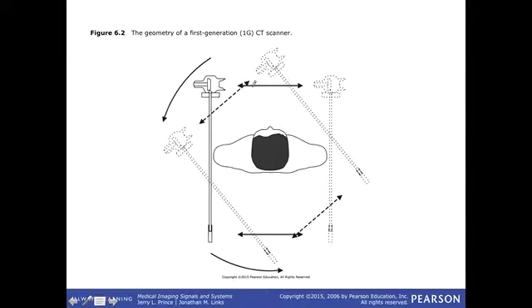And he said, yeah, that's okay, but on a chest X-ray machine, the beam comes out as a cone, right? And so it's really hard to reconstruct. It's not going to be that useful. So it turns out to be very useful. But anyway, yeah, you can just rotate the patient, right? You just need a different angle, different view.